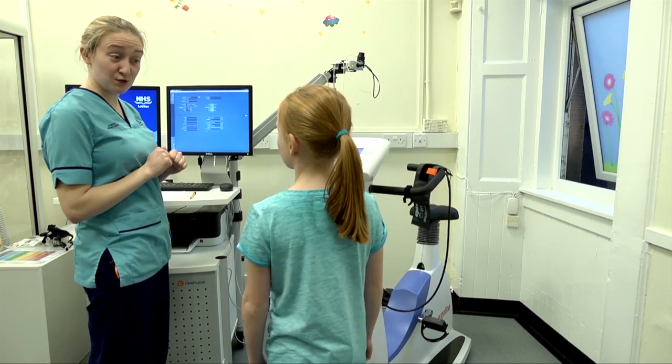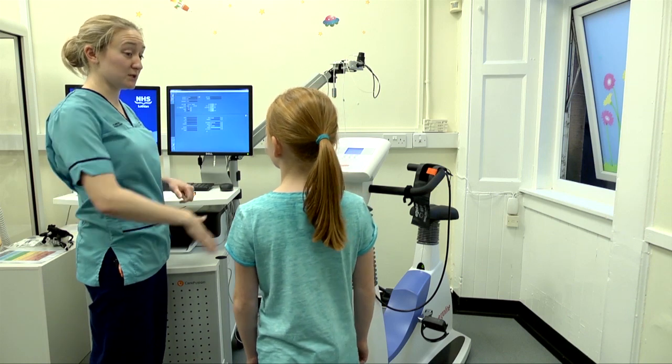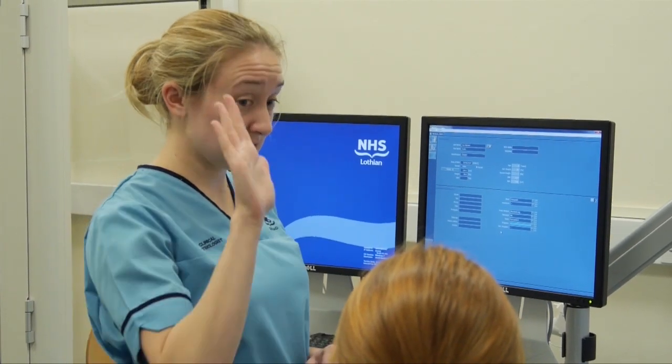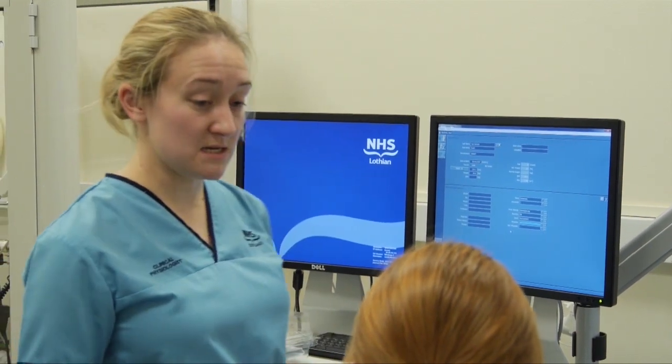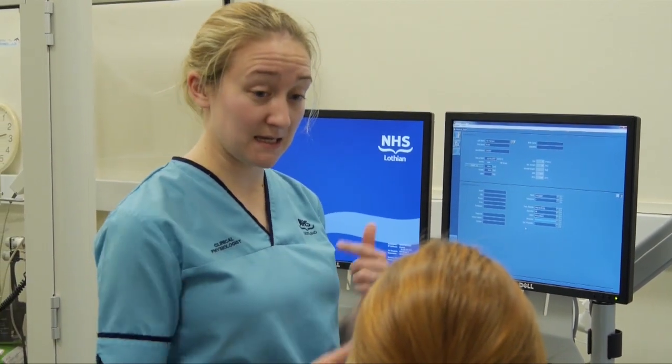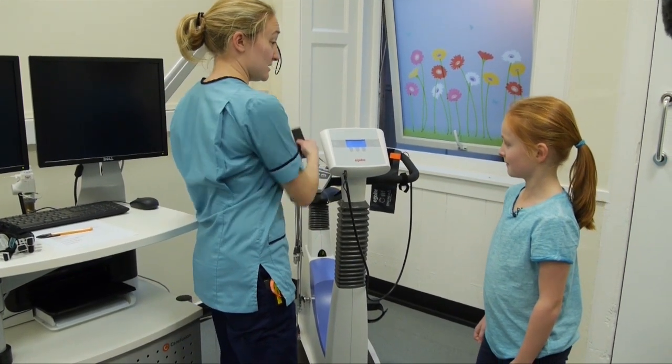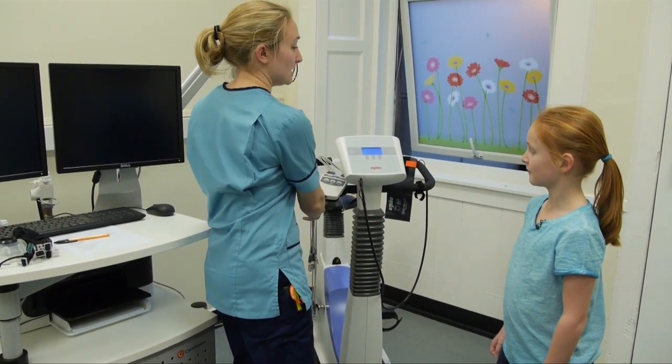If you really have to tell me something, you can, but use hand signals wherever we can. Now, when you get to the point where you really cannot do any more, I want you to stick your hand up in the air like that. Don't stop pedalling — stick your hand up. We'll hit the button on here that makes it nice and easy to pedal again. So what we'll do is take you through next door now for you to get your electrodes onto your chest and get you wired up.